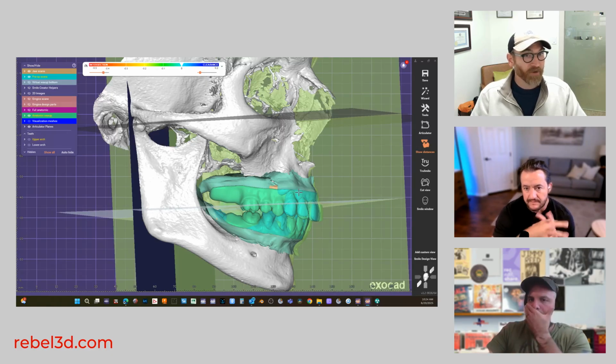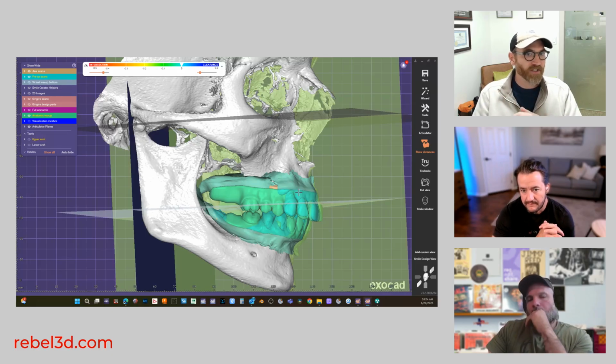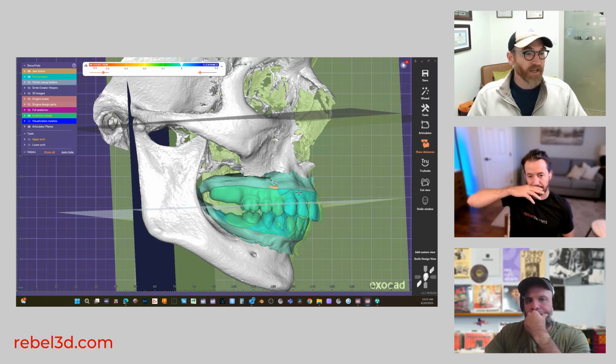So this is like communication. We're all a team, and we're all trying to work through problems. But clinical findings are an opportunity to make those design changes, and errors will occur, where nobody's perfect. And so your power as a clinician is how well you can prescribe the changes that you need to have made. Yeah. And that's the key.